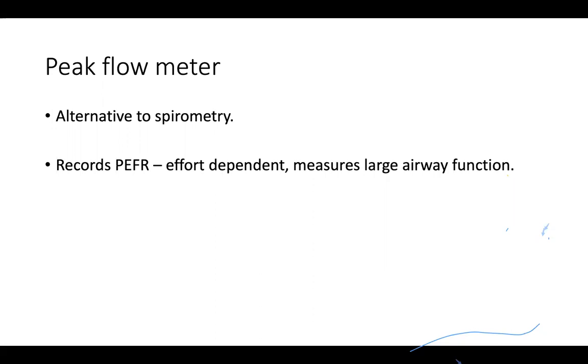The other pulmonary function tests available include respiratory muscle pressure measurement. This meter can determine the amount of pressure that they can generate. This is particularly useful for patients who have a neuromuscular disorder like Duchenne muscular dystrophy. You inhale into the mouthpiece and determine the pressures, and depending on the age-specific chart, you can determine how much pressure they are generating.